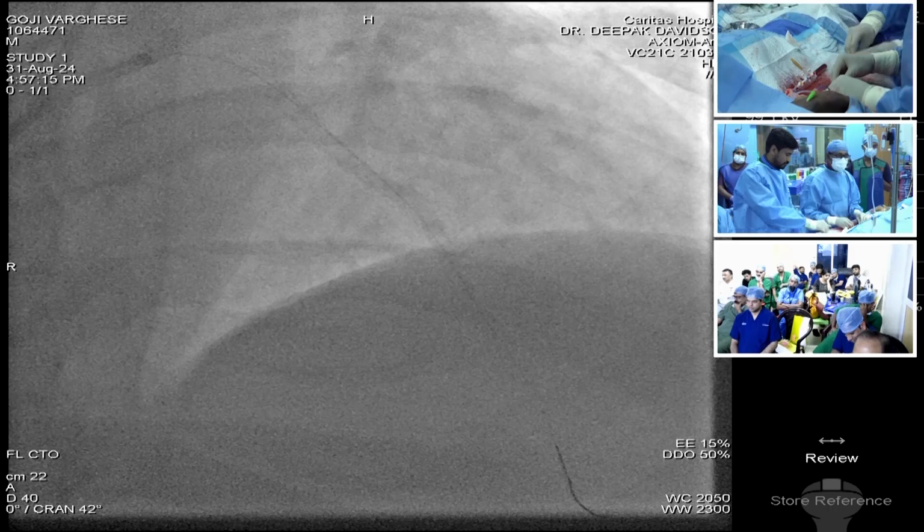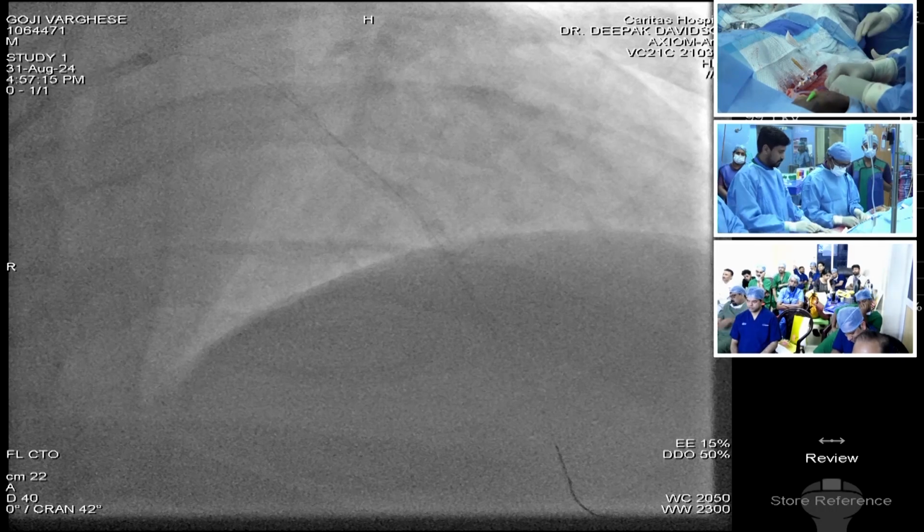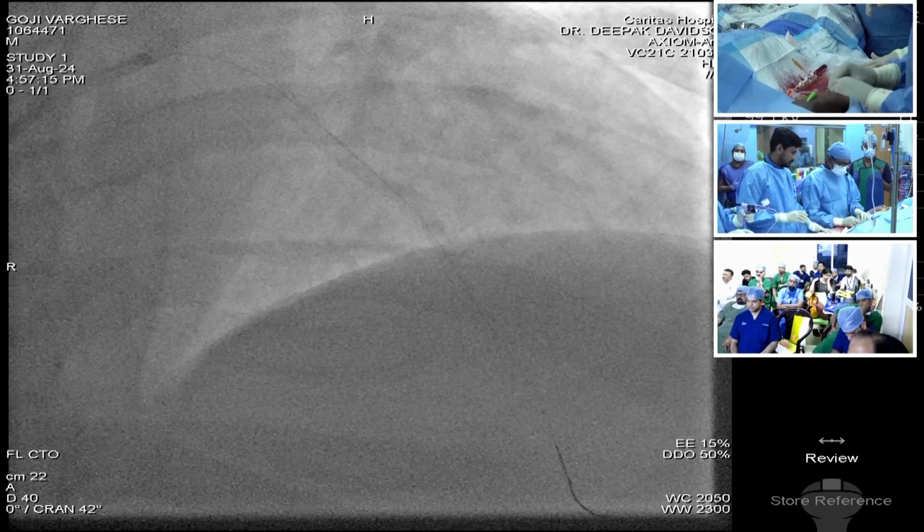12, 14, 16, 18, negative. This 3.5 into 8, is it? Okay.